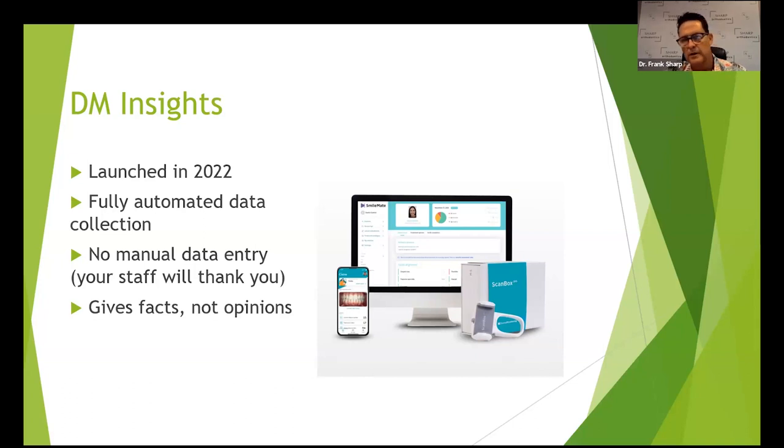And my friend Bill Lehman down in Tampa, Florida, does some great lectures on this, as well as Barry Benton. I think he's done several of those, and Tara Gostovich as well. And what it does, you can compare about anything in your practice, be it aligner patients to braces patients. If you're using one aligner company and you're using a second aligner company, you can compare and contrast how patients do with those.